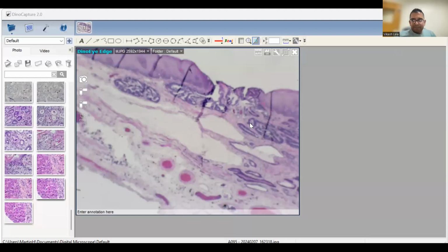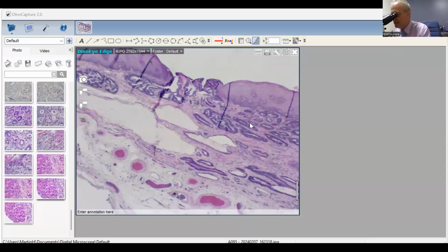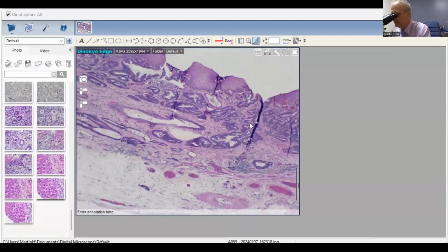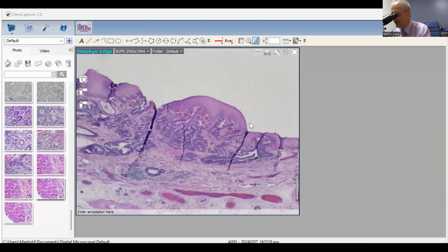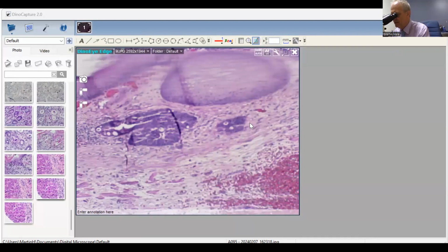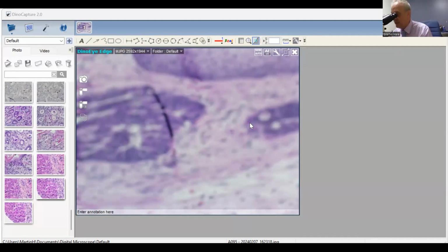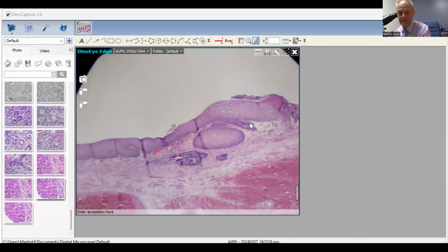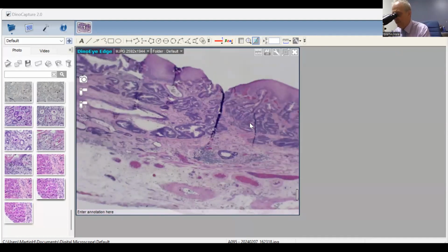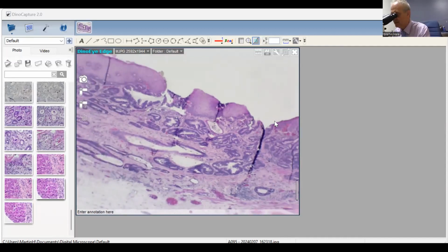So there is the squamous mucosa. And look at this extensive infiltration beneath the mucosa by infiltrating adenocarcinoma. And even down here, there's this island of infiltrating adenocarcinoma. Now, all Vikash would have seen was squamous epithelium on the surface. And if he was lucky, he may have picked up this irregularity in the mucosal surface. But that's all he would have seen.